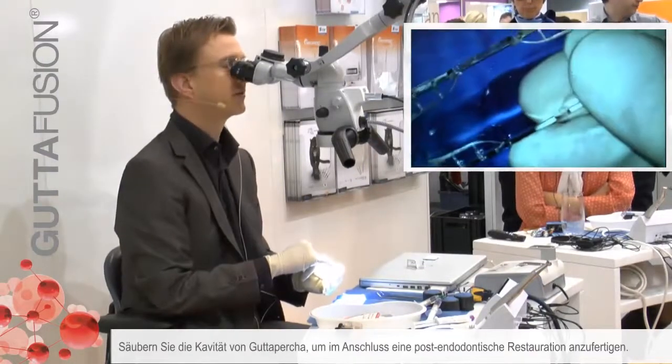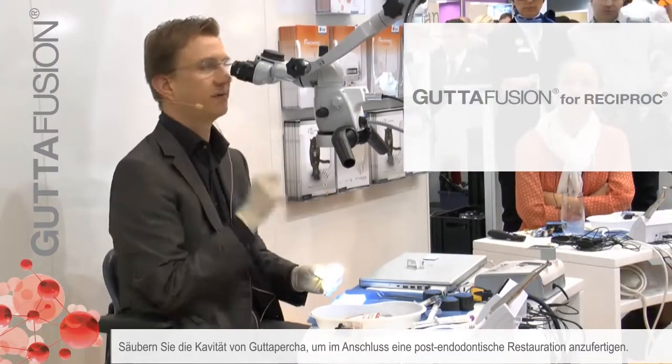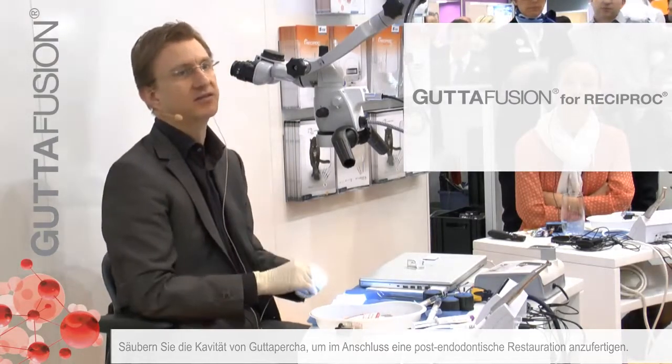I would continue to clean the cavity of the gutta-percha and then place a post-endodontic restoration.